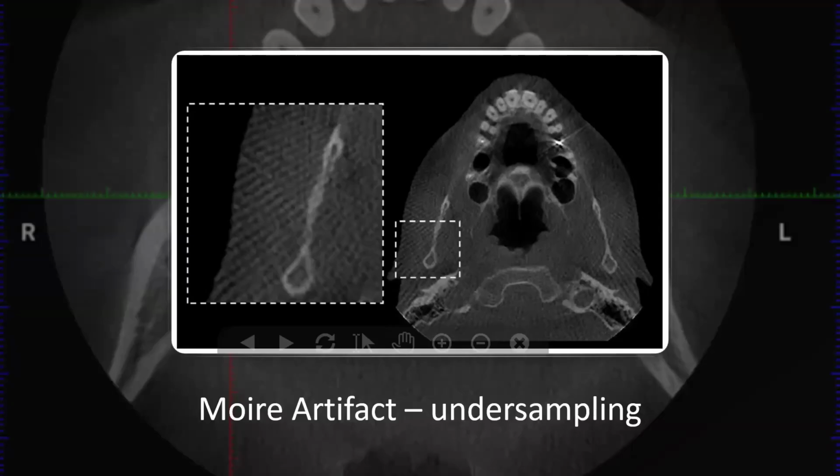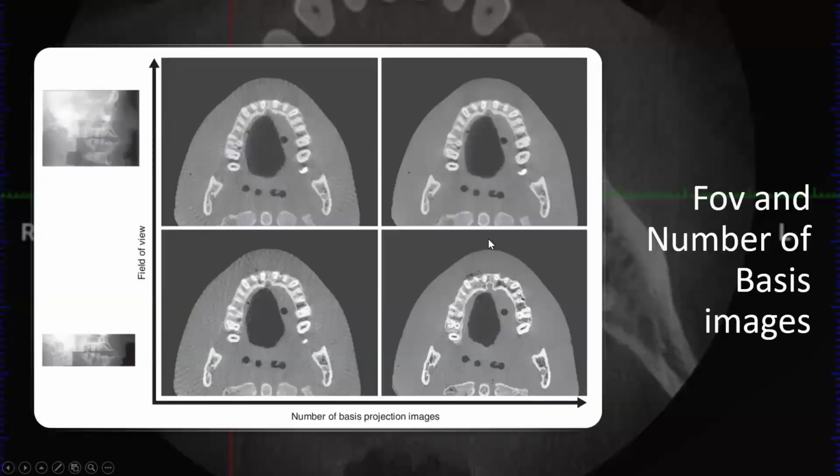Maybe you only have a couple hundred projections when you could go to more, because then the software has a tough time putting those projections together, and it creates these light and dark lines that are striating from the center. But really a similar idea to noise: if you increase the number of projections, or if you increase the time or mAs, this is going to go away. So I think of those two as really similar.